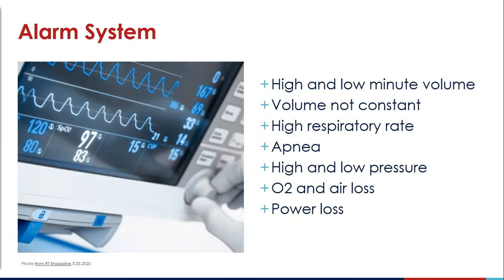Alarm system. High and low minute volumes, volume not constant, high respiratory rate, apnea, high and low pressures, oxygen and air loss, and power loss.